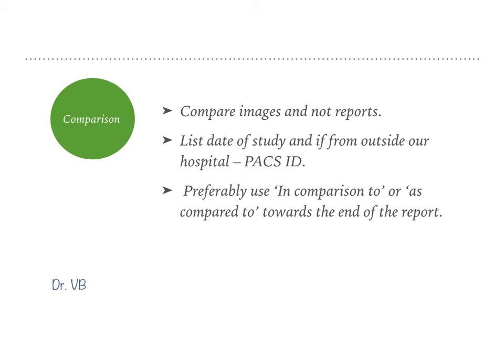Ideally, compare images and not reports. If you always have a previous study, please compare the images and make sure you document the date of the previous study. There is a preference to use statements regarding comparison towards the end of your report after documenting your findings, so that the person reading the report can have an idea of what exactly are the newly developed changes that have appeared.